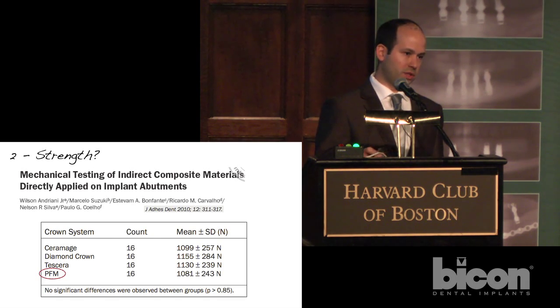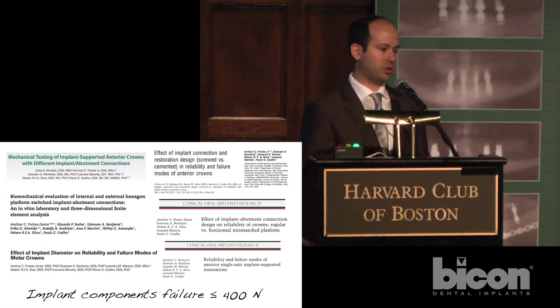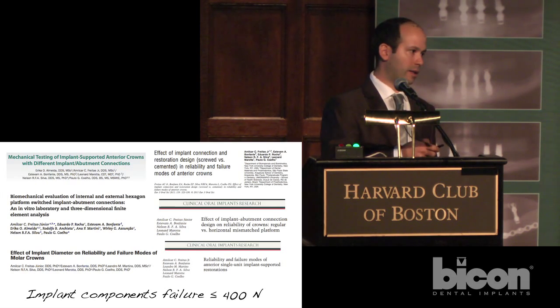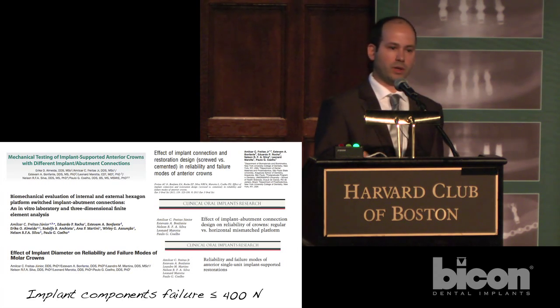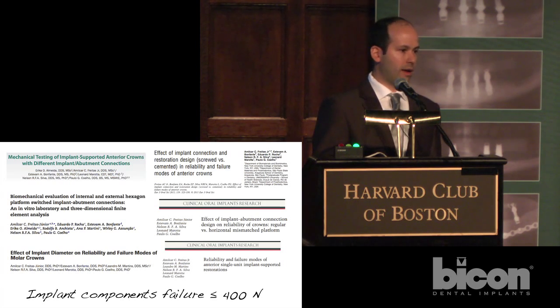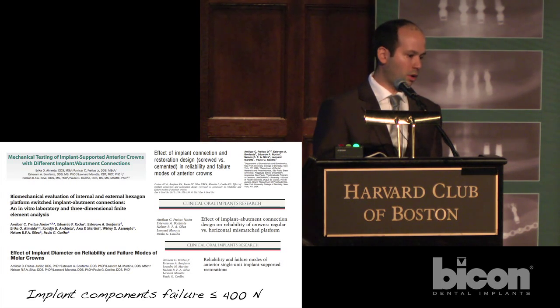So just to give you an example, half a dozen examples out of our over 20 publications on the topic, where we have investigated, for example, the effect of implant abutment connection designs, external hex, internal conical connections, or the difference between screwing or cementing a crown over an implant, differences between platform switching and matching platform implants, and the combination of all of these.